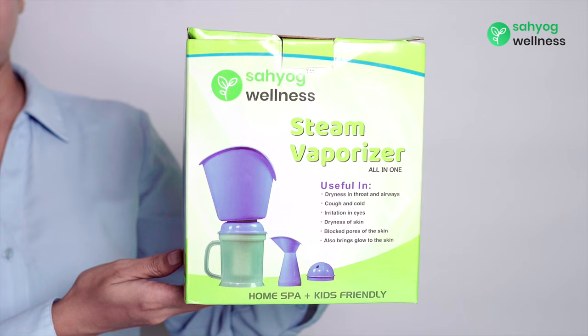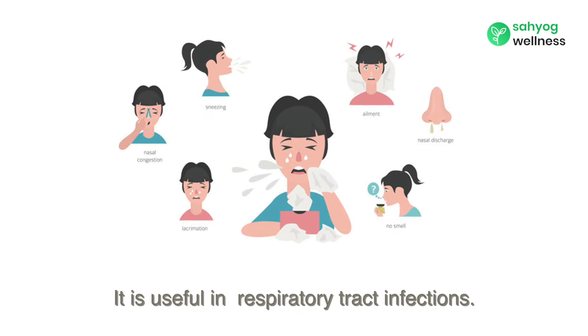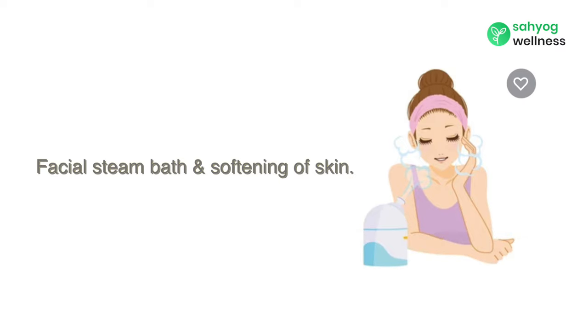Introducing Sahyog Wellness 3-in-1 Steamer Vaporizer. It is useful in respiratory tract infection, facial steam bath, and softening of skin.